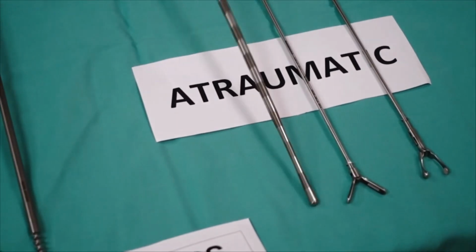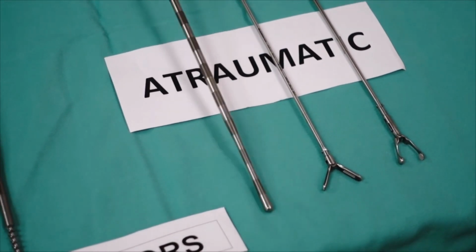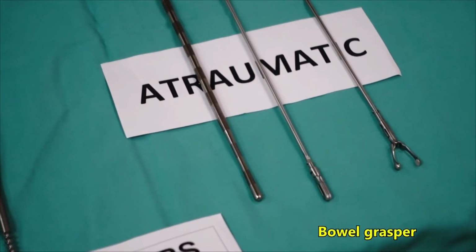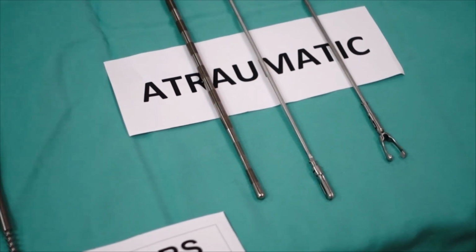Such as a palpation probe, okay? Unless of course you use force, you can injure the tissue, but basically you can hold it. This is a bowel grasper, okay? This is your Babcock, okay? Now the other instrument is your traumatic instrument.